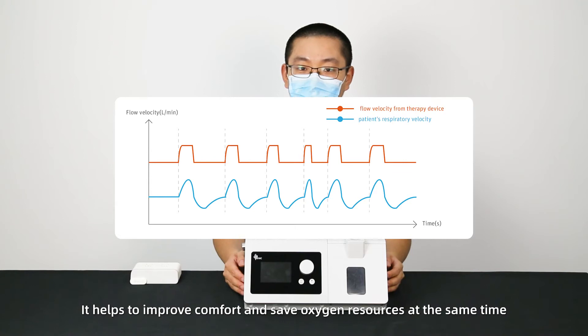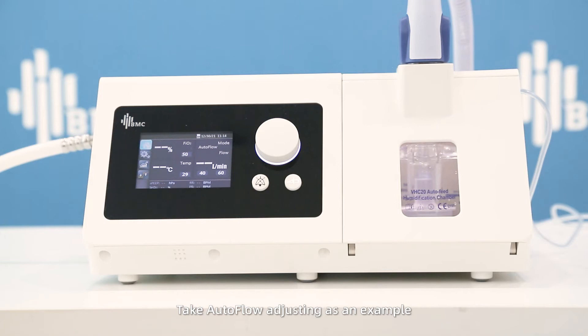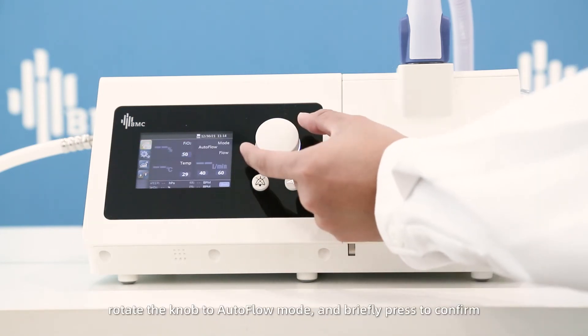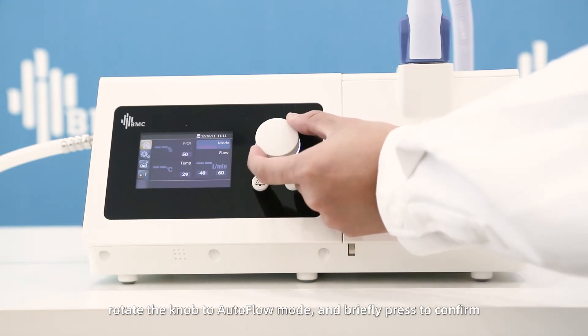Take auto flow adjusting as an example. Briefly press the selected mode, rotate the knob to auto flow mode, and briefly press to confirm.